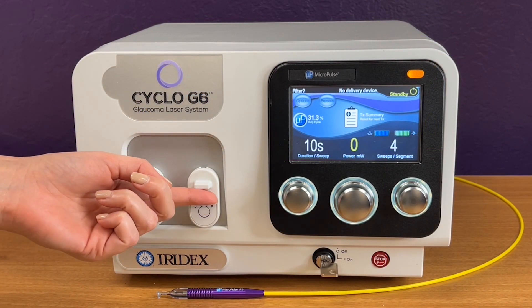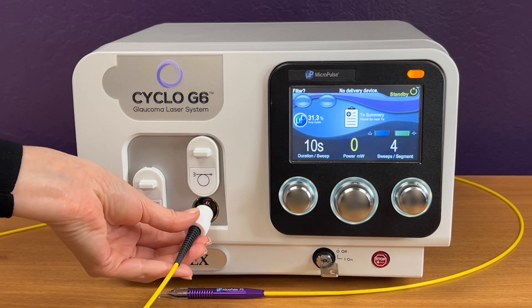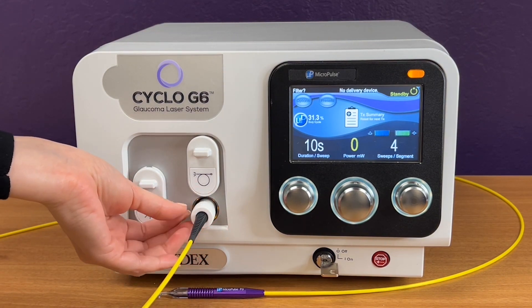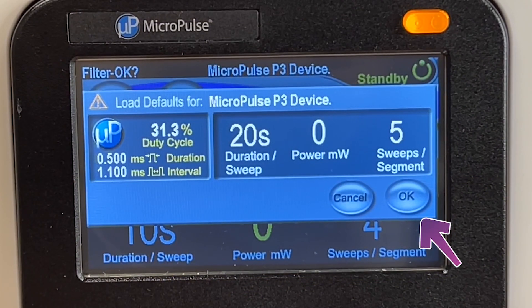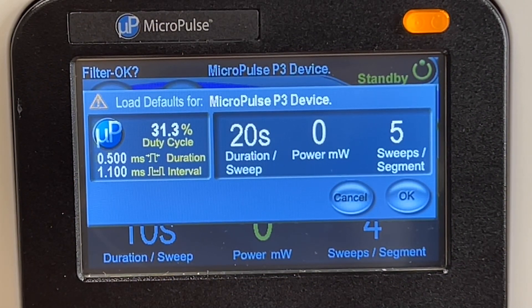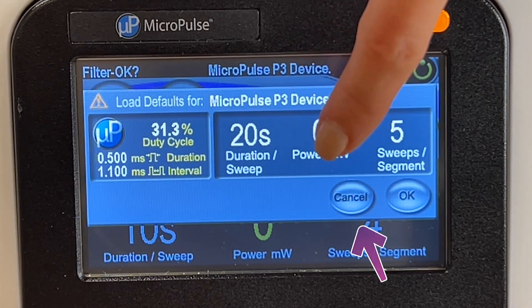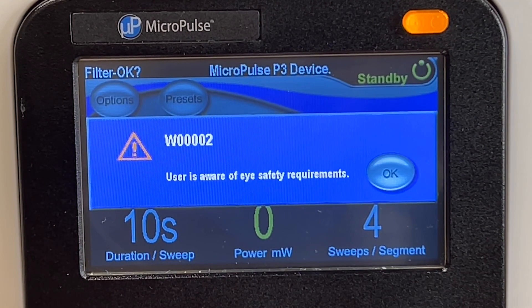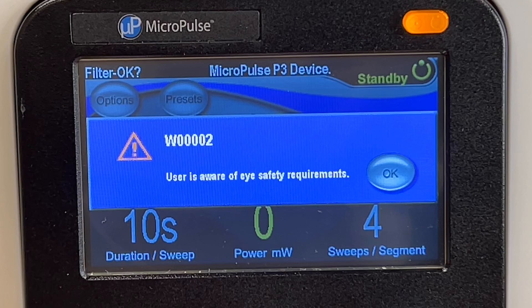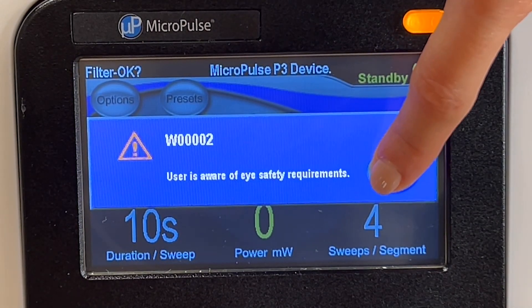When the Micropulse P3 Probe is connected to the Cyclo-G6 laser, a screen appears that confirms the delivery device and default parameters. Select either OK to load these parameters and adjust them based on your preferred treatment settings, or select Cancel to retain the settings used in your prior Micropulse TLT treatment. Regardless of selecting OK or Cancel, this screen will appear as a reminder of the eye safety requirements when performing laser treatment.